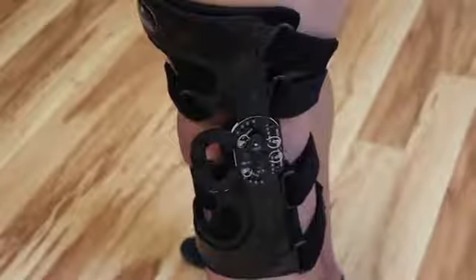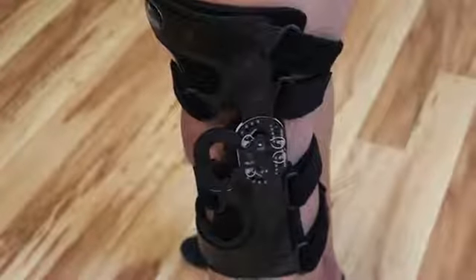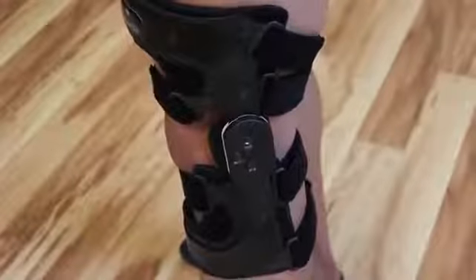Open the plastic cover of the hinge. A medical professional should adjust the flexion and/or extension according to the patient's need.